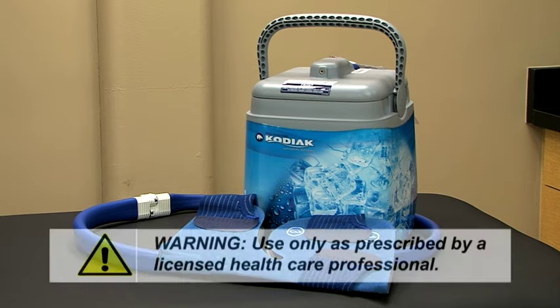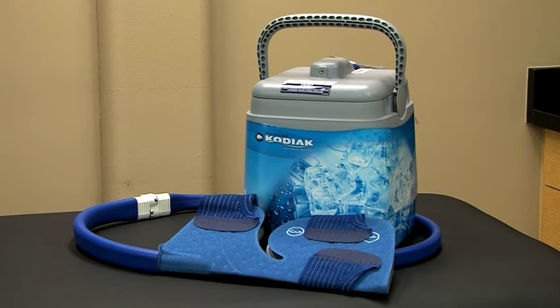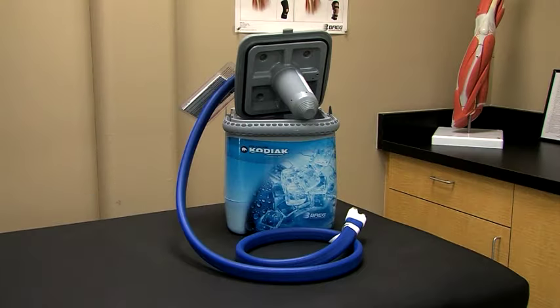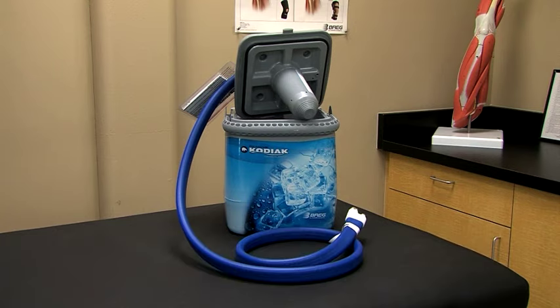Be sure to use the PolarCare Kodiak as prescribed by a licensed healthcare professional, including how often and long to apply and when to take breaks from cold therapy. While there are many benefits to the use of cold therapy, a word of caution: cold therapy systems can be cold enough to seriously injure the skin, so be sure to follow these instructions carefully.